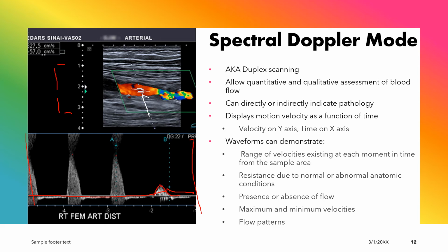So if I had velocity of blood consistently moving through here and it took a reading and it gauged that there were velocities between, let's say, about 120 centimeters per second all the way down to some turbulence in the negative velocities, it would draw a line representing all of those velocities. However, a moment later during diastole, this same cursor would be taking in information from the Doppler flow, and it would recognize only a few negative velocities or reversal of velocities. And so you should see that represented with a very small reversed line.